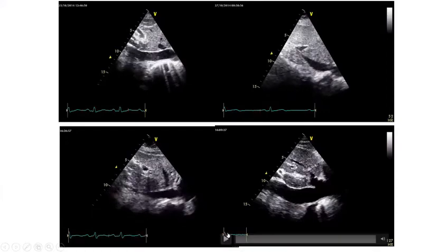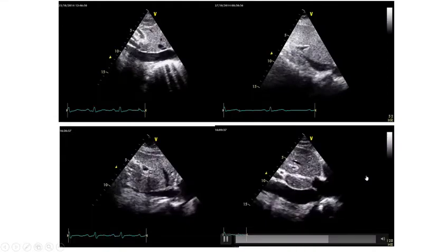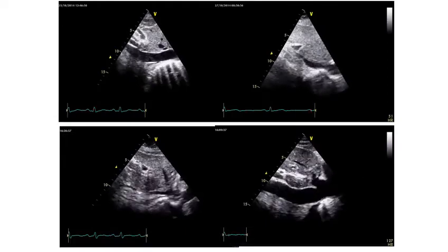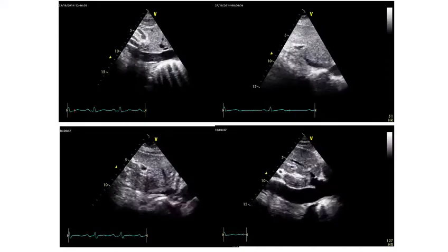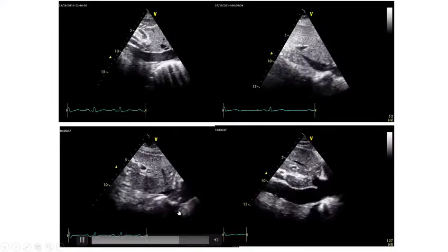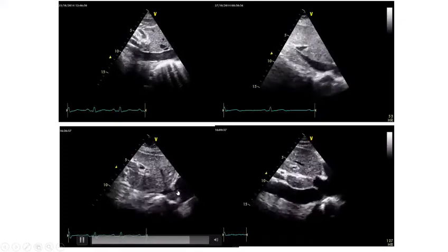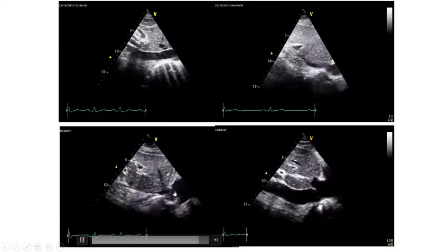Second one, it is having less than 50% respiratory variation. I mean, respiratory variation is low. What do you mean by that? Actually, in the second and third, in the third one especially, hypovolemia. Because the IVC is collapsed. The third one is completely collapsed IVC. So the patient is in hypovolemia and may be in hypovolemic shock. And right atrial pressure can be as low as?